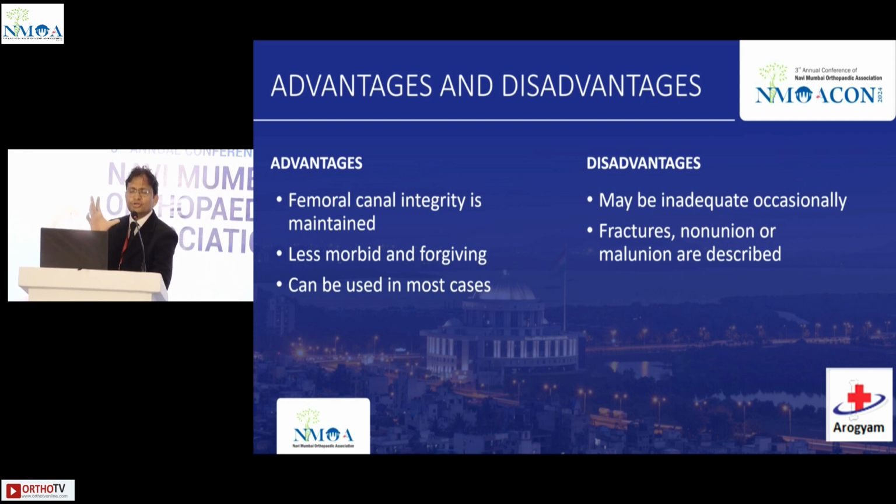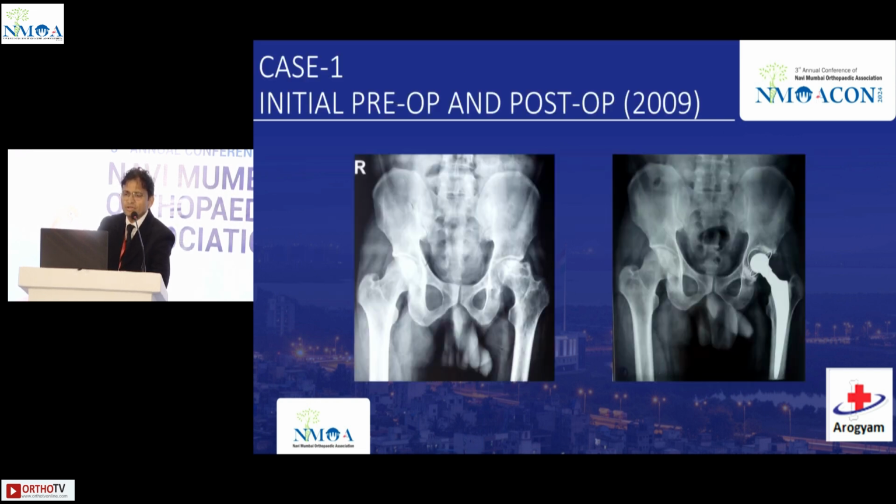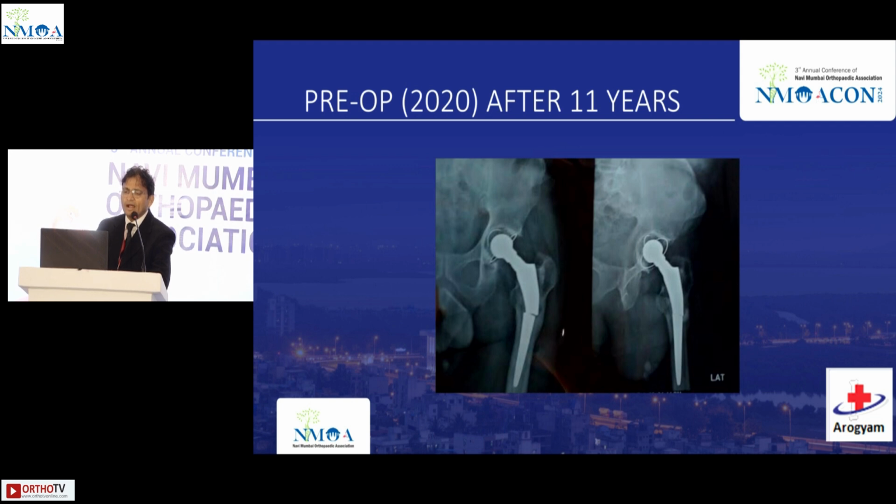It can be used in, say, a completely fully coated uncemented stem, well fixed, where there is a fracture. And it can lead to fractures as well. Non-unions and malunions are also described in the literature. So this was a case operated around 2009, a well-done cemented THR, and after 11 years the stem broke, and at that time the patient came to us.